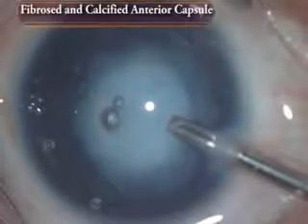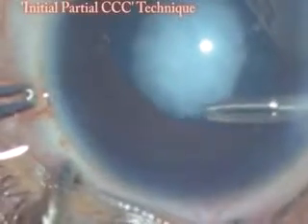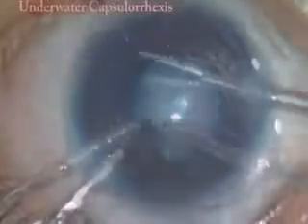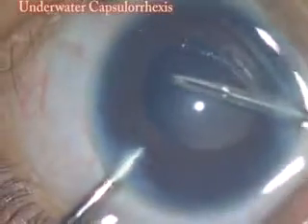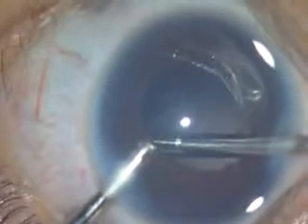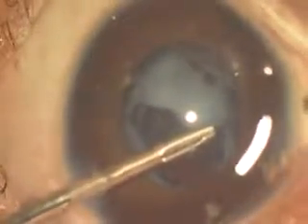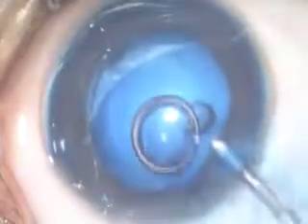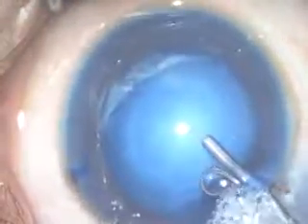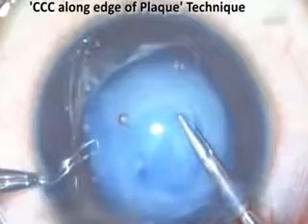For a fibrosed and calcified anterior capsule, perform an initial gentle capsulorhexis. Carefully aspirate the lens and follow it up by completing the rest of the anterior capsulorhexis with a pediatric capsulorhexis forceps, taking utmost care not to apply any undue pressure on the zonules. Use a pair of micro scissors to cut the fibrosed capsule without stretching the zonules. For central anterior capsular plaque, first ensure adequate viscoelastic insertion and then perform a gentle capsulorhexis along the edge of the calcified plaque.